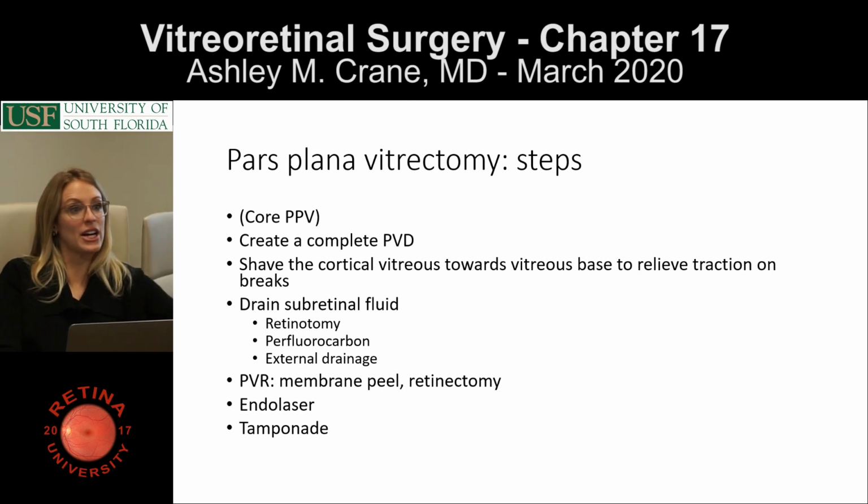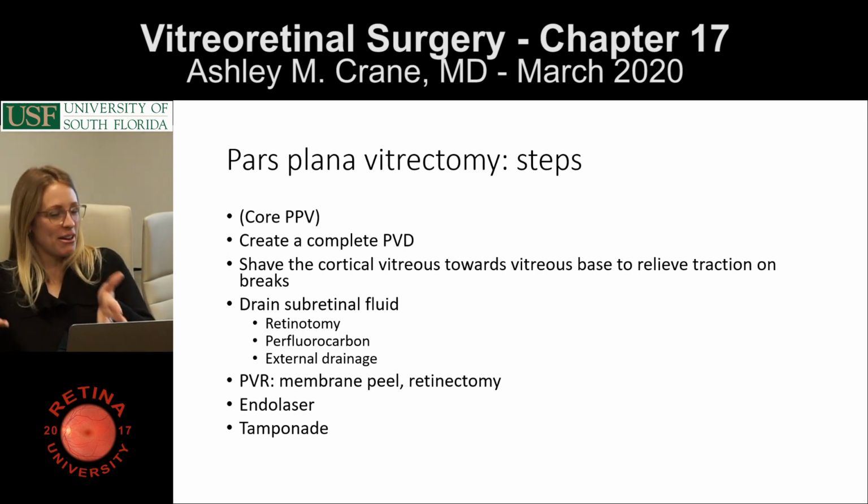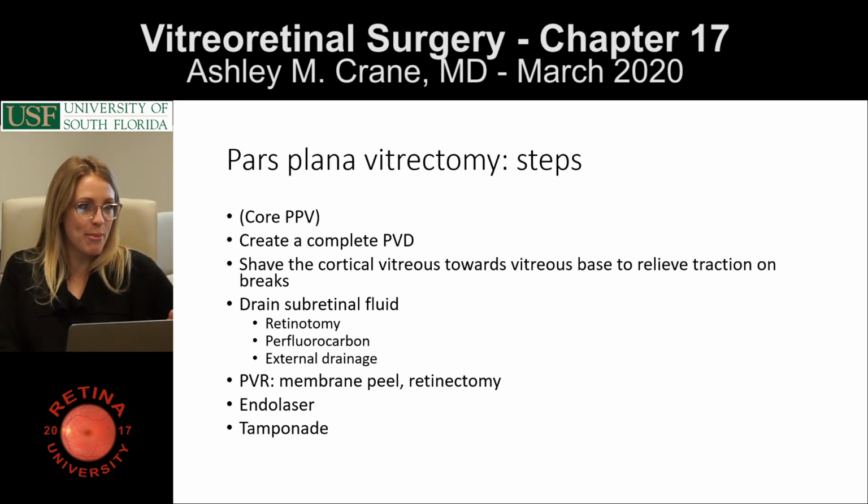You can't laser over detached retina. So that's an important part, and something that when you're learning is a step that gets missed. I would remember the residents that just missed it, if I would have them dictate, the residents would just miss that part, and I would say, well, they don't know exactly what's happening in that step.